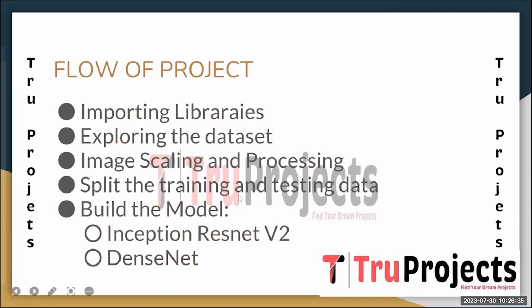And the next one is splitting the training and testing data. To evaluate the performance of our model, we split the dataset into two sets, a training set and a testing set. The training set is used to train the deep learning model, while the testing set is used to evaluate how well the model generalizes to unseen data.